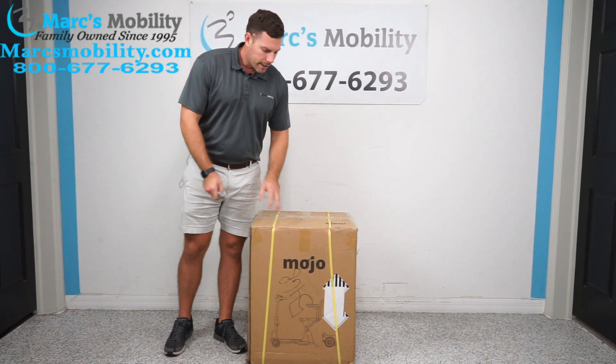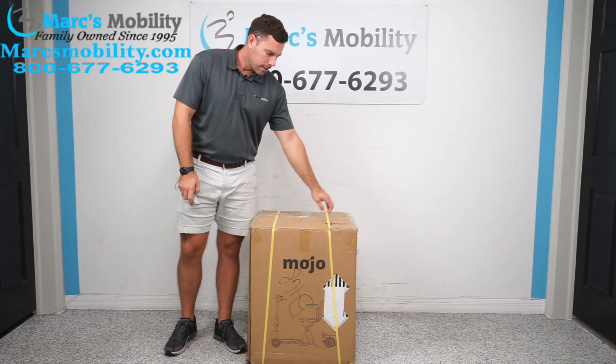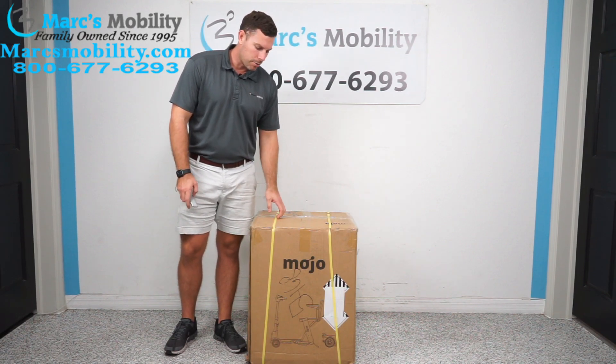This is what the unit would look like when it ships. They do ship FedEx or UPS, fully assembled in this box. You do have hard straps that go around it, so you're going to need a box cutter or a knife.